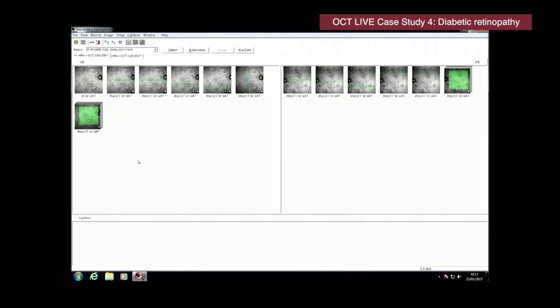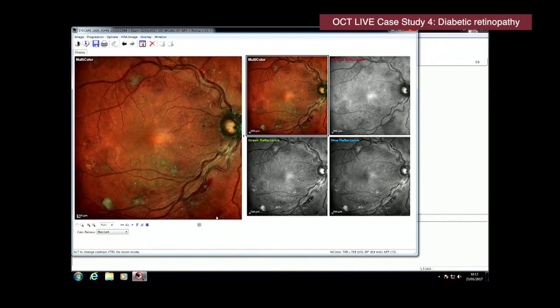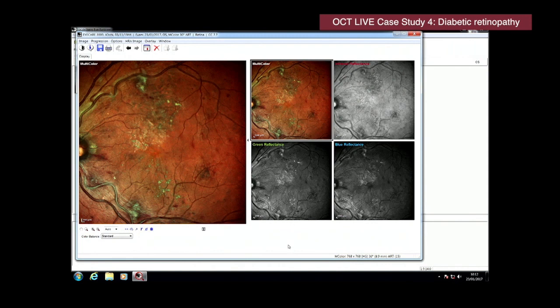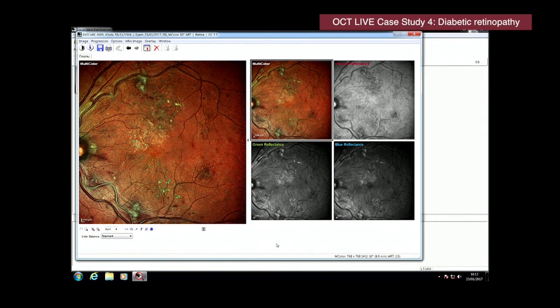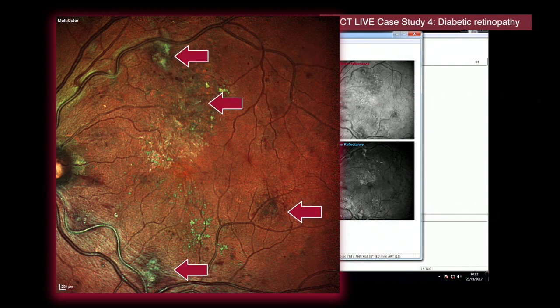Okay, Phil, could we just quickly look at the previous scans that we acquired, and we just had, if we just pull up the colour picture of the other eye, actually, please. Sorry, Phil. Okay, so again, this is a colour picture that we acquired just before the start of this session. Okay, and again, we can see an awful lot of important changes simply within the fundus image. Lots of highly reflective material, which is very likely to be exudate. We've got these areas here, which is all areas where we can see leakage.